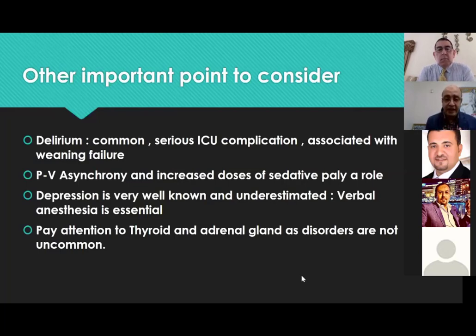An ICU per se is a serious environment to cause delirium. Most, if not the majority, of our drugs used in ICU cause delirium. Mechanical ventilation causes delirium. In continuity with mechanical ventilation, patient-ventilator asynchrony: if you are ventilating for 3 or 4 or more days and the asynchrony index is high, this indicates that you had a patient who suffered this whole journey on mechanical ventilation, and don't expect them to travel through the journey of weaning very smoothly. So you have to be ready, once you put your patient on the ventilator, to take care of patient-ventilator agreement or synchrony. It has to be fulfilled in a smooth way. Otherwise, if they are asynchronous, most of the time they're going to fail.